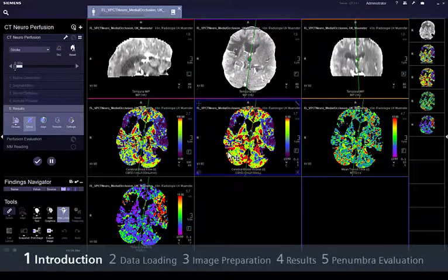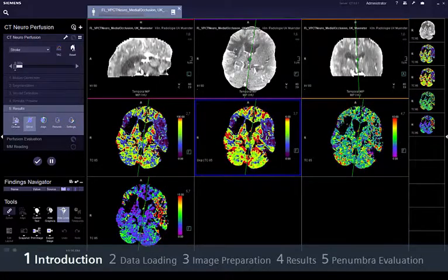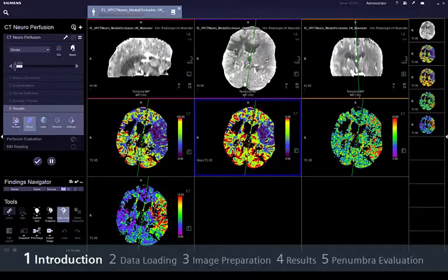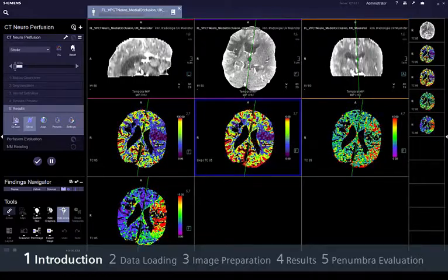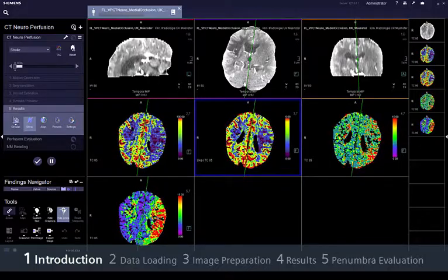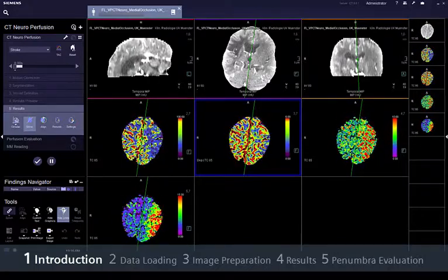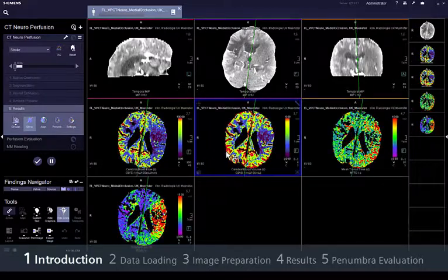CT imaging has always played a major role in stroke imaging. In addition to non-enhanced CT imaging and CT angiography, CT perfusion imaging helps to improve the selection of different treatment options for stroke patients. The guided workflow provided by CT neuroperfusion facilitates routine 24-7 operation.